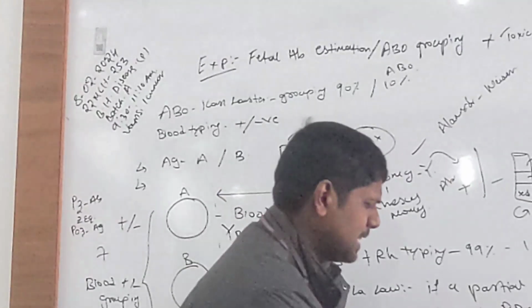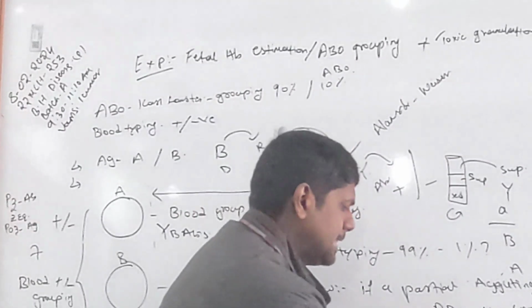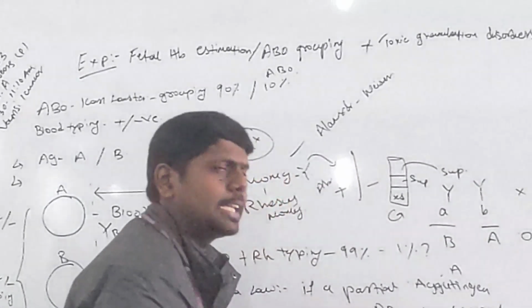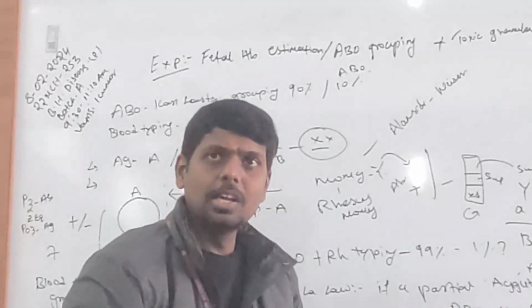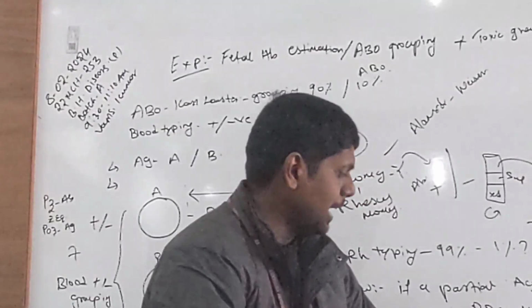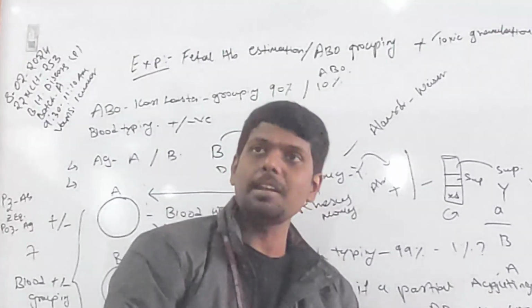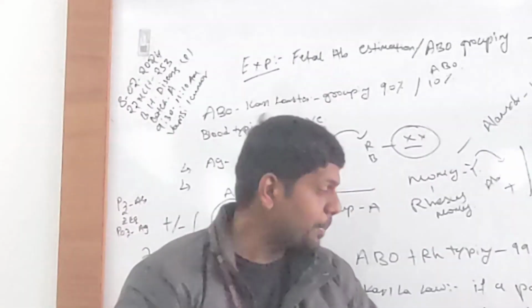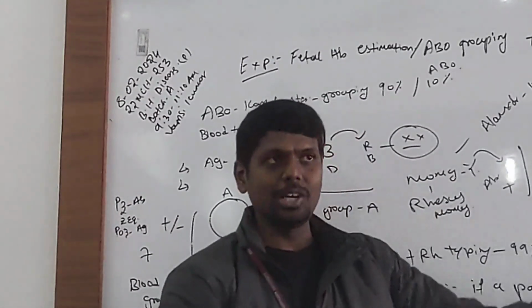Some abnormal antibodies in the recipient attack the donor cells. I don't know what those abnormal antibodies are. So before you go for your grouping, first detect the recipient antibodies. Is there any abnormal antibody in the recipient targeting the donor cells? For that purpose, I must know his antibodies first. Hence, I will go with reverse grouping.